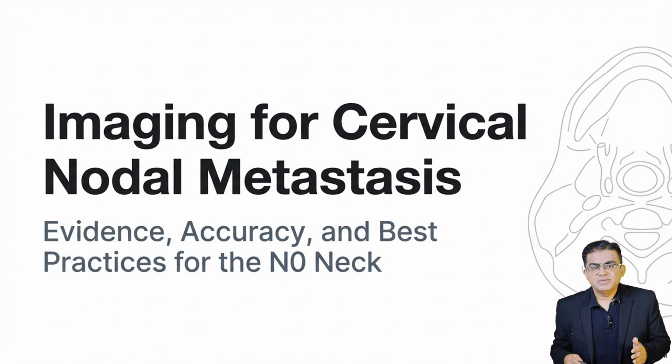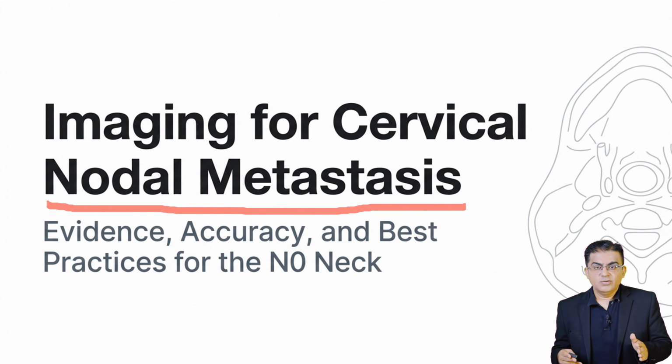Alright everyone, listen up. We have thoroughly discussed how to image the primary tumor. We know now how to check for the bone and we know how to trace the nerves. But as any good oncologist knows, the primary tumor is only half the battle. The single most important prognostic factor in oral cancer that dictates your patient's survival is cervical nodal metastasis. So let us shift our focus to the neck, specifically the clinically negative or N0 neck.